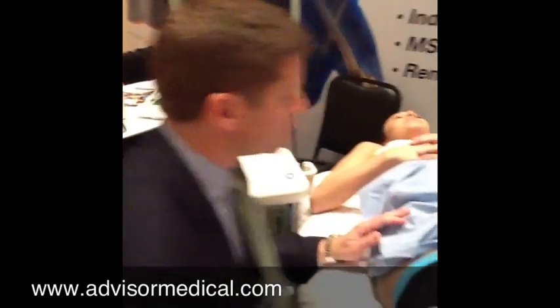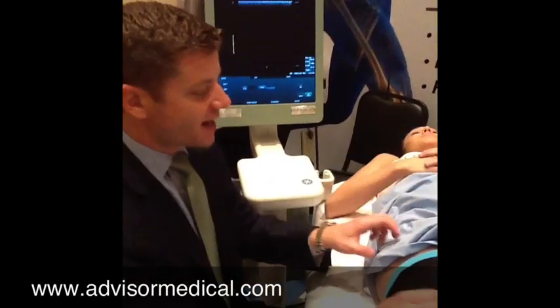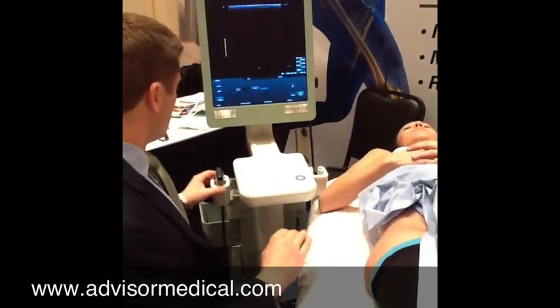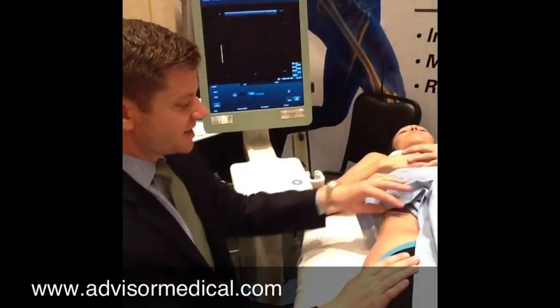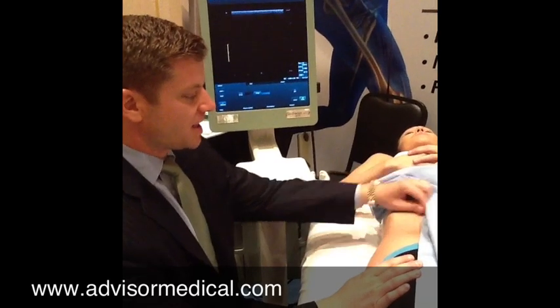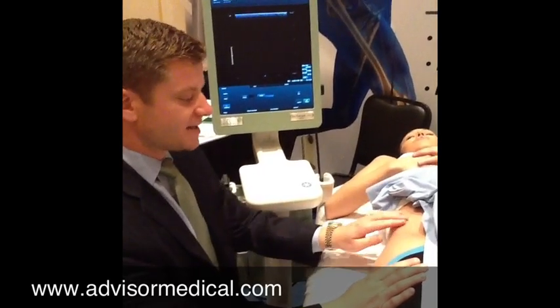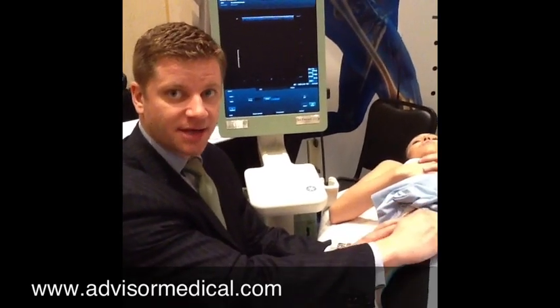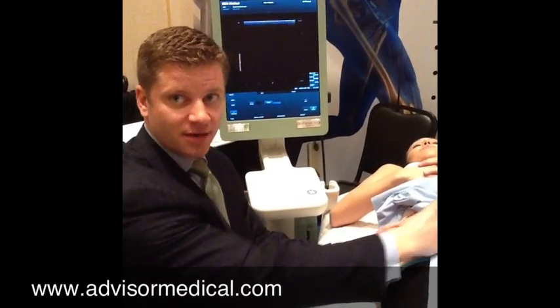As far as setting the patient up, have the patient lay on their back and then expose the hip area. What we're going to do with this technique is basically take the ASIS and the pubic bone and draw an imaginary line — that's where we're going to start with this technique.